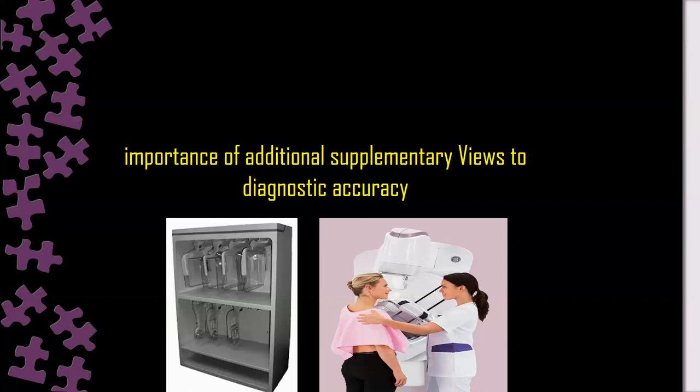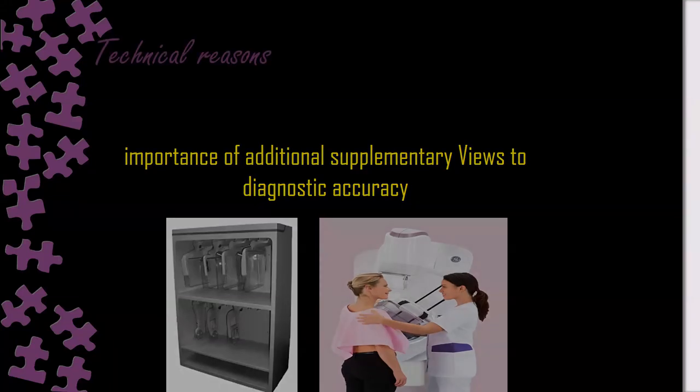Excellent, excellent. Lesions in the medial lower quadrant, mid lower quadrant. For example, we use for it the valley view or the cleavage view. Excellent, well done. Specific locations. Okay, so we have technical reasons and we have diagnostic reasons.